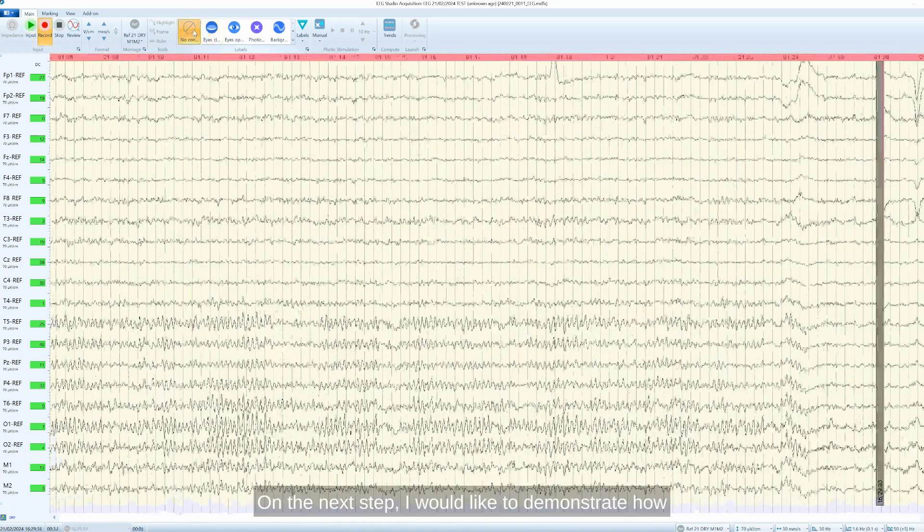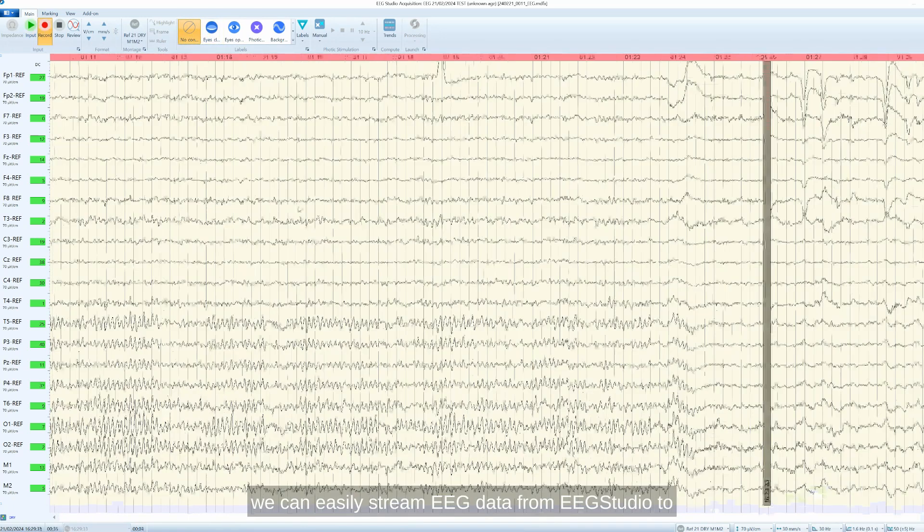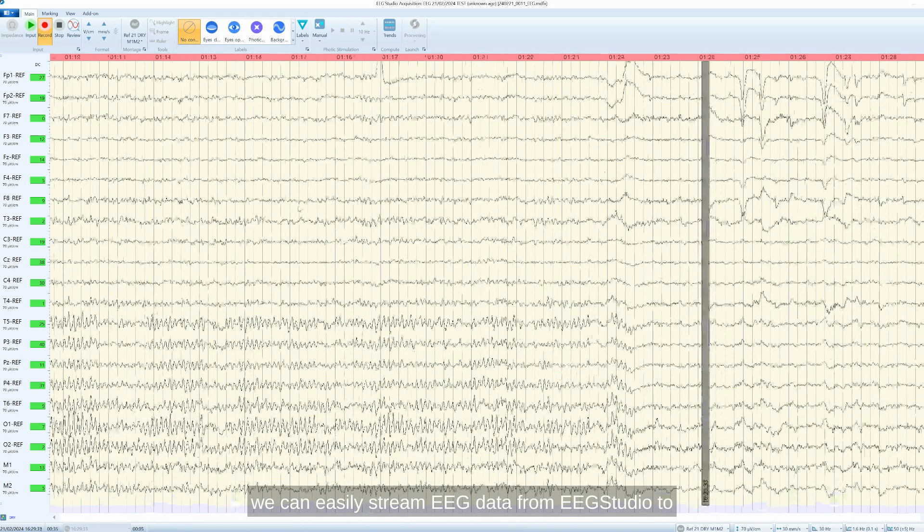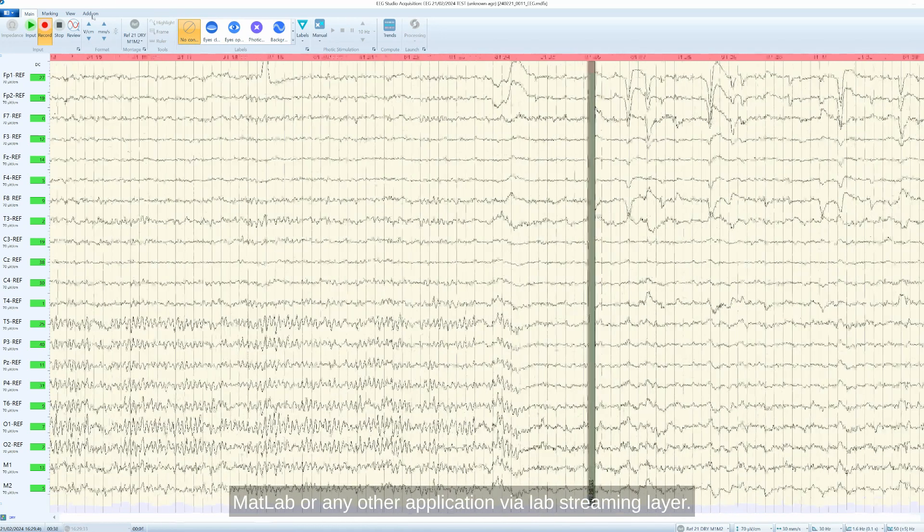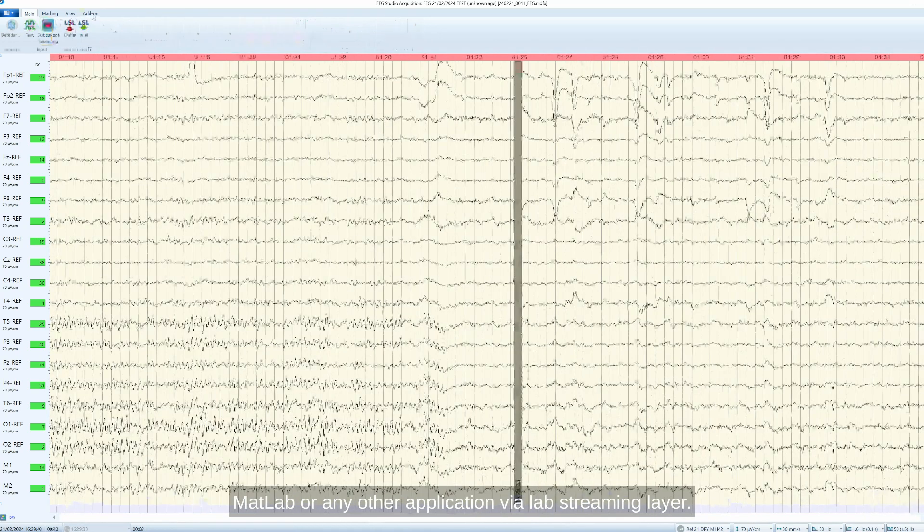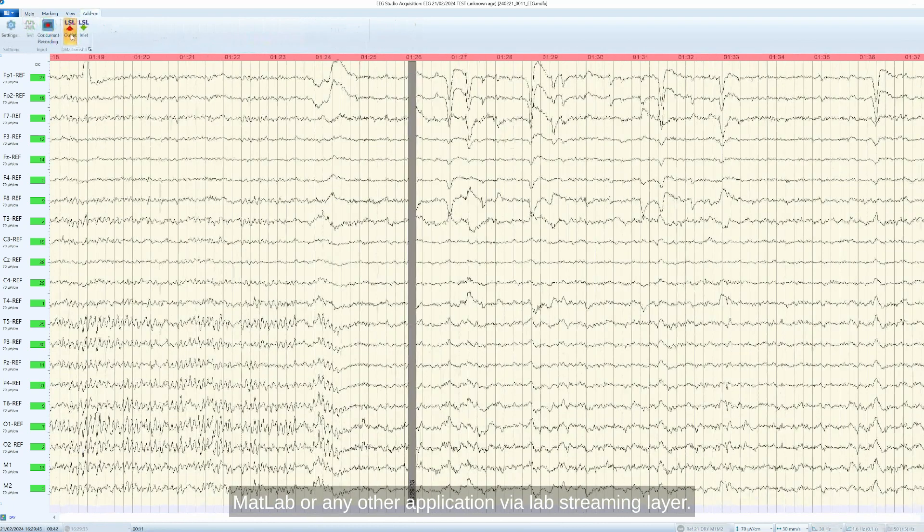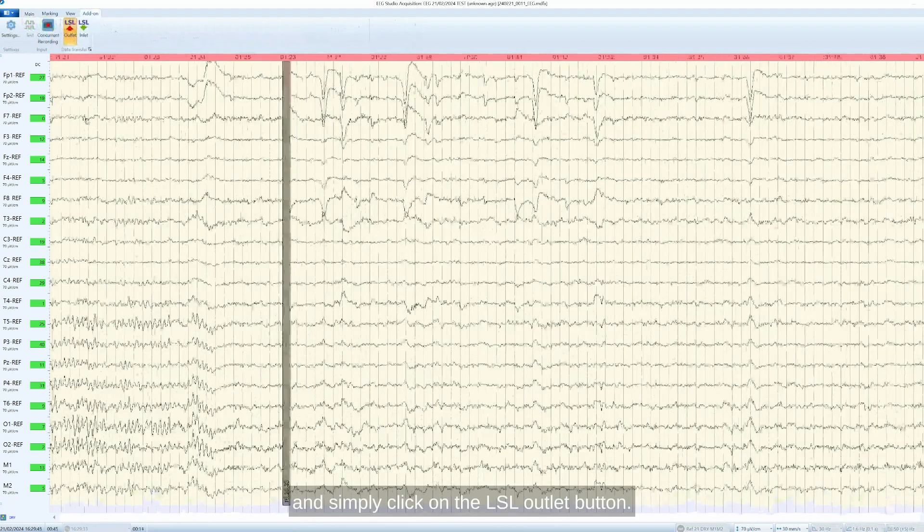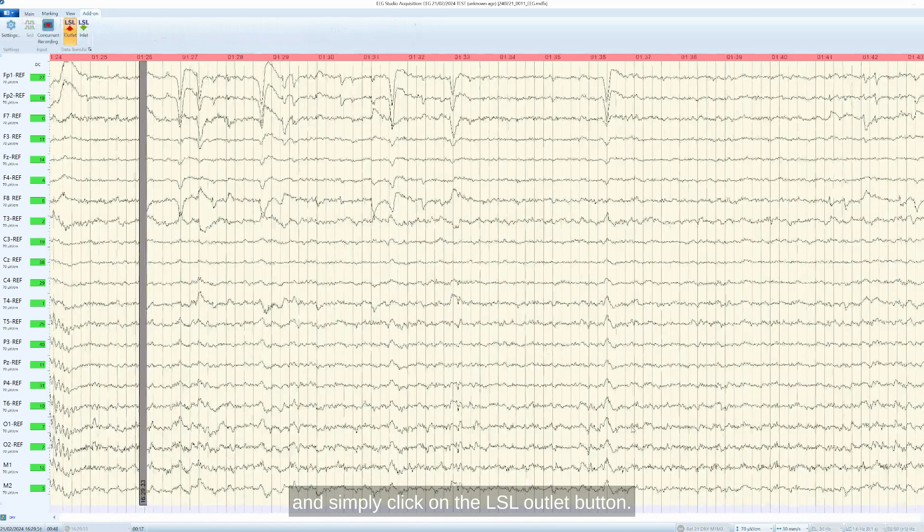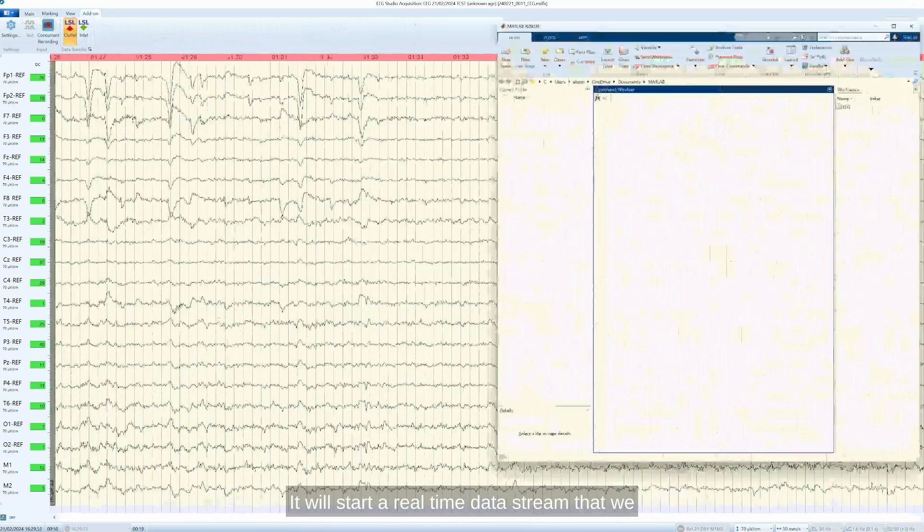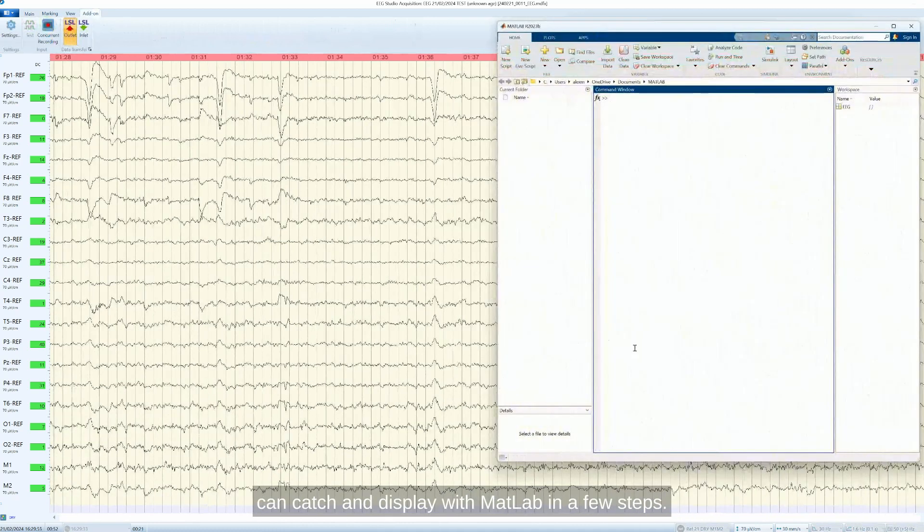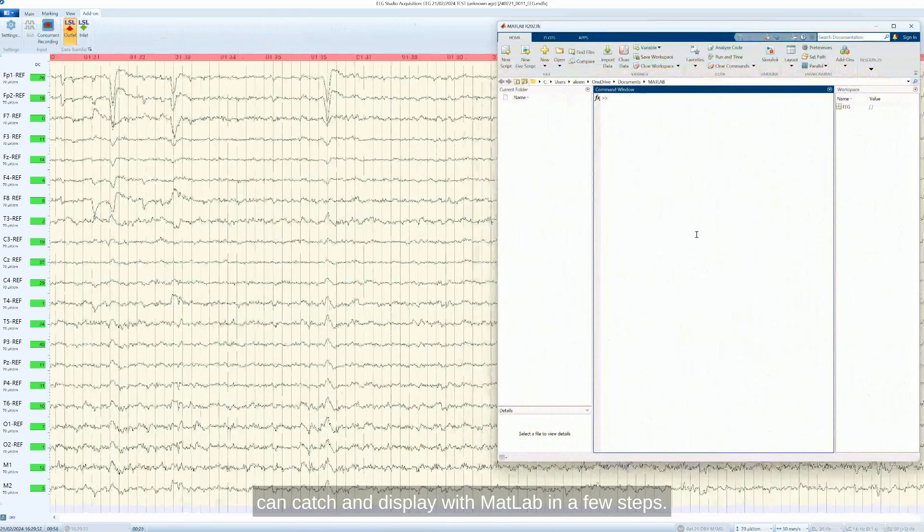On the next step, I would like to demonstrate how we can easily stream EEG data from EEG Studio to MATLAB or any other application via lab streaming layer. We are going to switch to the Add-on tab and simply click on the LSL Outlet button. It will start a real-time data stream that we can catch and display with MATLAB in a few steps.